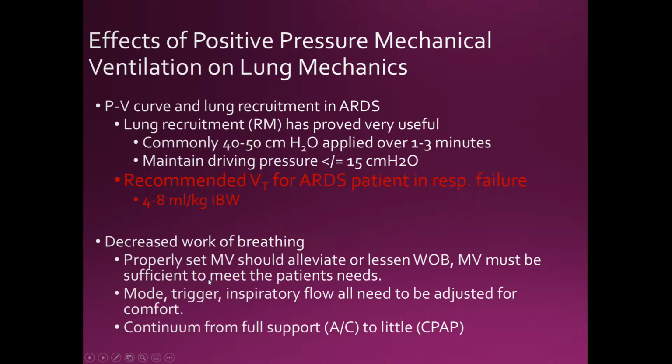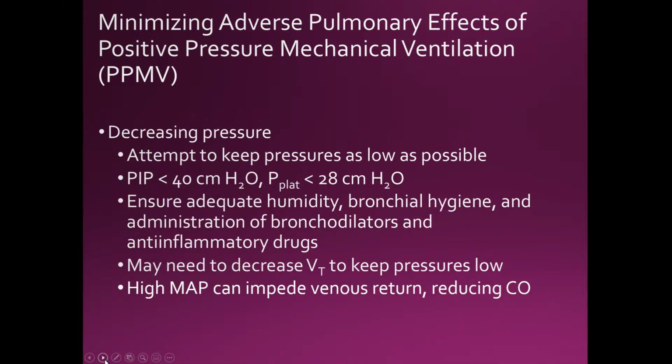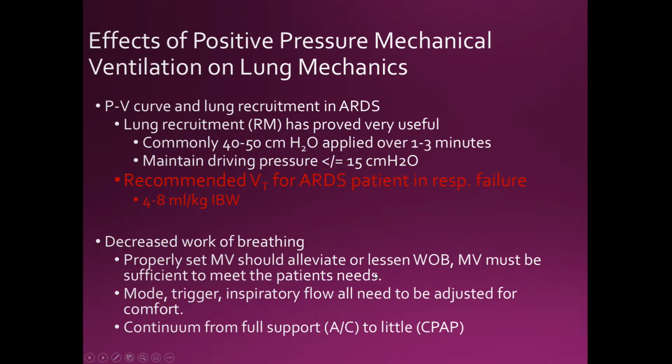Now, one thing with decreased work of breathing. If you set, let's say, hypothetically, the patient is on a PEEP of 5, and the patient is auto-PEEPing at 8. You would want to set your trigger or your sensitivity at -9.